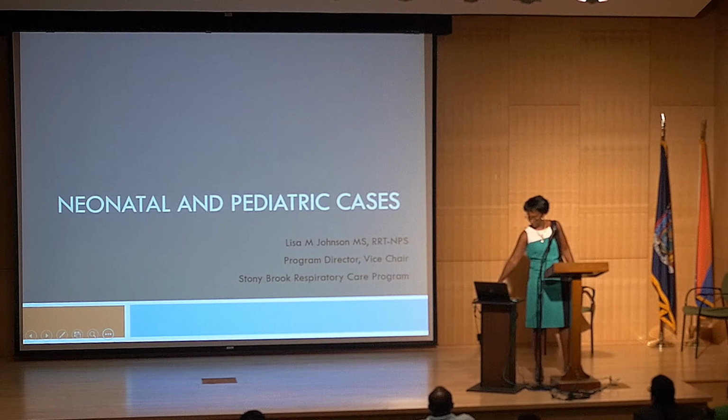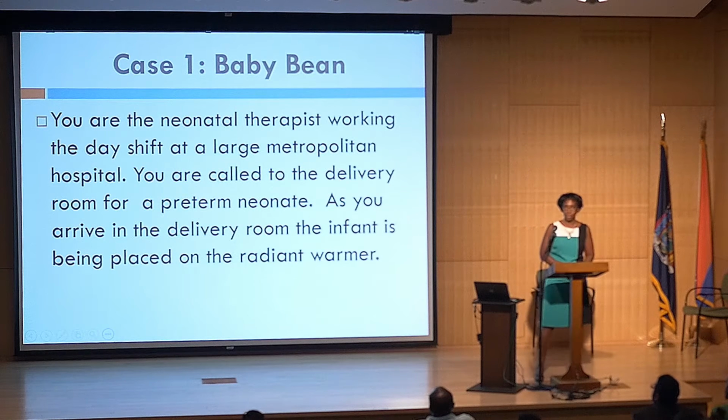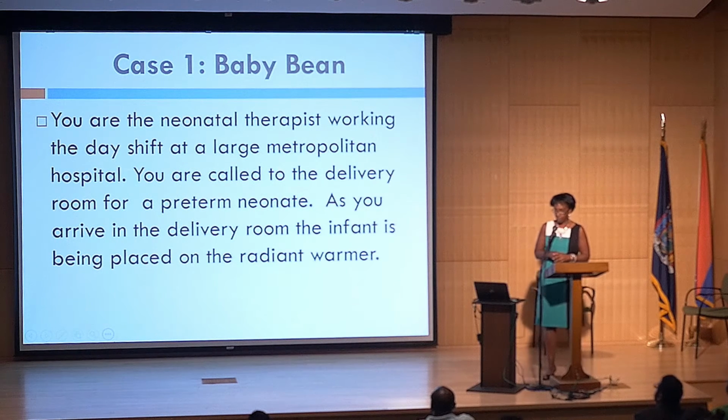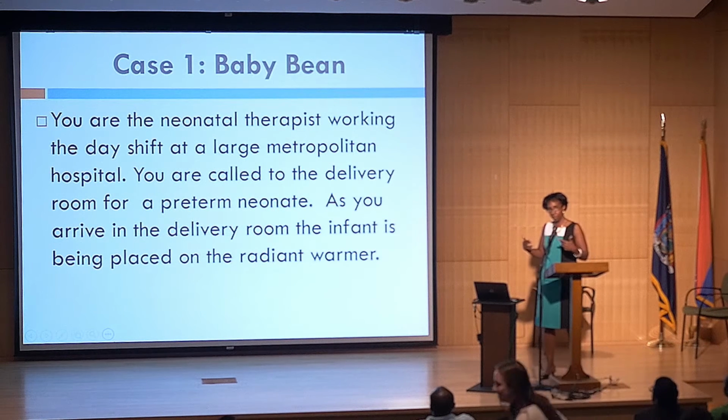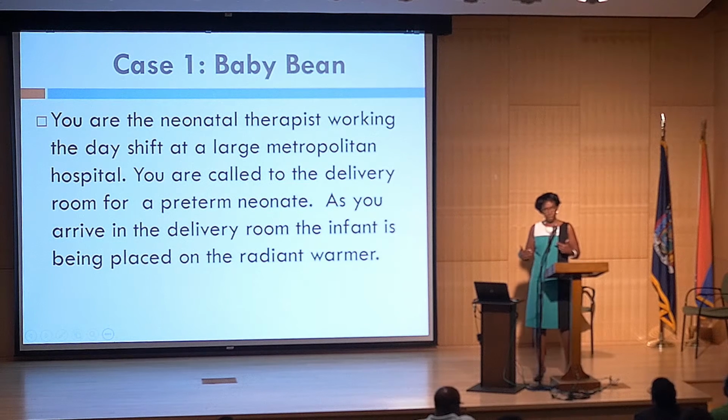So here we go. This is our first case. This is Baby Bean. Baby Bean, you are the neonatal therapist working the day shift at a large metropolitan hospital. You're called to the delivery room for a preterm neonate. As you arrive in the delivery room, the infant is being placed on the radiant warmer. So now what you need to start thinking about is, now that I'm here at this large hospital, and I'm coming into the delivery room, what do I want to know about what's going on?